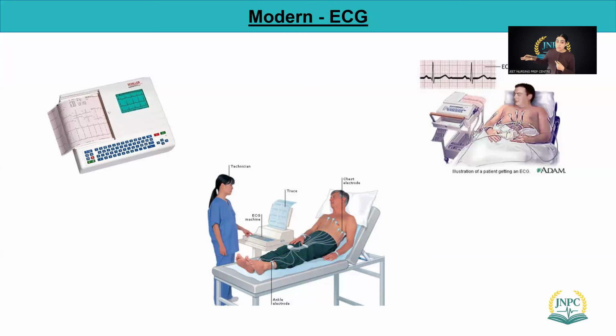If they're experienced, maybe, but that's not under their scope. But can they put those electrodes on and get that ECG? Yes, they can, because putting on those electrodes does not require critical thinking. Competent and experienced LPNs or RPNs can do it, but the interpretation is always done by us, by RNs.